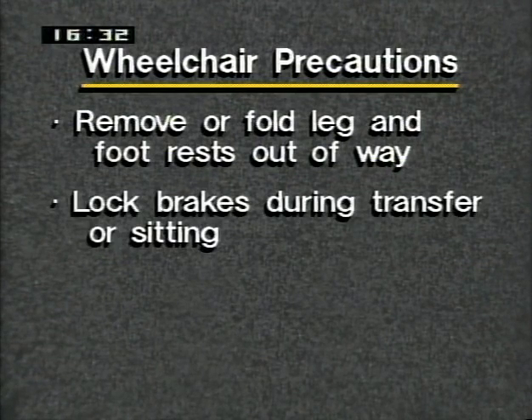Remove or fold the leg and footrests out of the way during the transfer. This will prevent the chance that your patient will bump his legs or feet. Always remember to lock the brakes when transferring the patient in and out of the chair, or if the patient will be sitting in one place for an extended period of time.